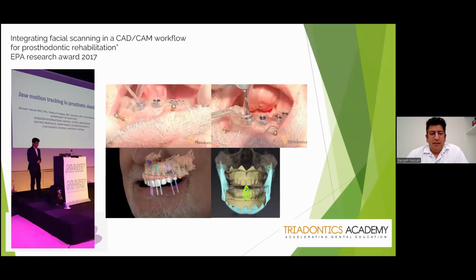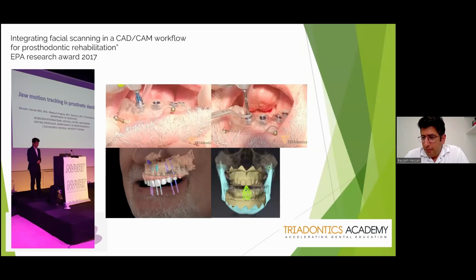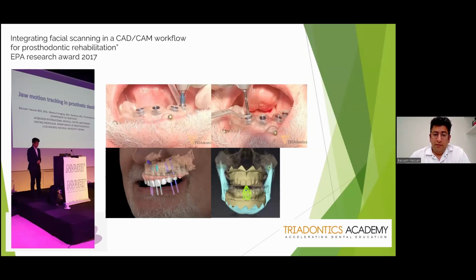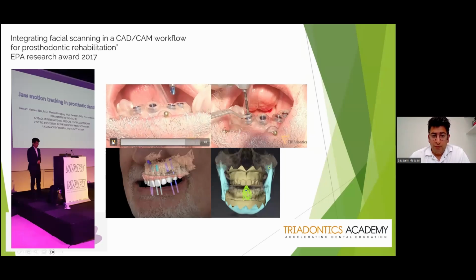We will be discussing the difference between bone-supported guides, soft-tissue-supported guides, and tooth-supported guides, and the protocol that you have to follow, and what you need to pay attention to when doing guided surgery. We will also discuss the difference between guided surgery and digital planning. I always say you don't have to do a surgical guide for every case, but you need to do digital planning for every case so that you know what you are going to be doing.